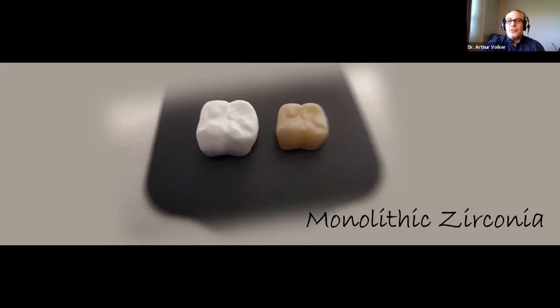Just so that you know, you cannot really add zirconia to zirconia. What laboratories will typically do in that case, if you send it back and you say, hey, listen, I got an open contact, or just blame the lab. It's just easier to say that you did it, it's your fault. And say, hey, the contact was open. Typically, if they do not remake the crown, what will most likely happen is that there will be an addition made, usually with a glass ceramic, and typically, so far as I know, with feldspathic porcelain, because they can add to it and get pretty decent adhesion of it. But just please be aware that if you have an open contact, you don't necessarily want to tell the lab to make it over, but be aware that that proximal contact may actually be in a glass ceramic, even though you have an otherwise monolithic zirconia restoration.